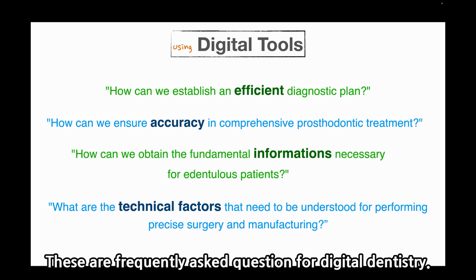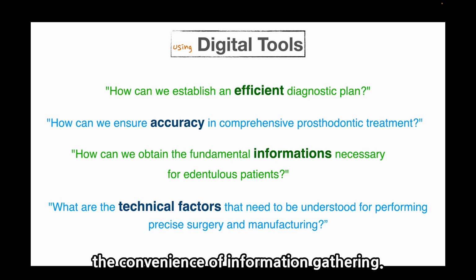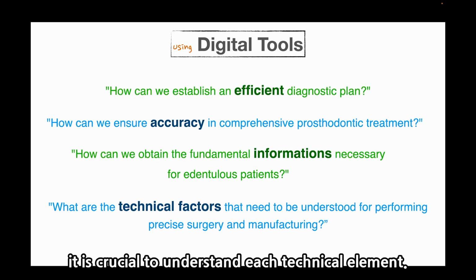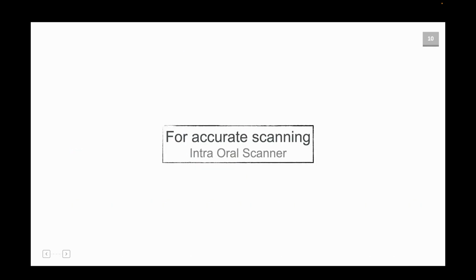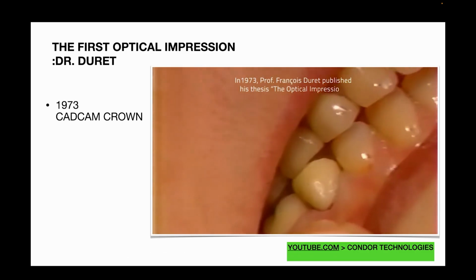These are frequently asked questions for digital dentistry. They are about the accuracy and the convenience of the information gathering. To concretize these aspects, it is crucial to understand each technical element. Let's think about accurate scanning first.